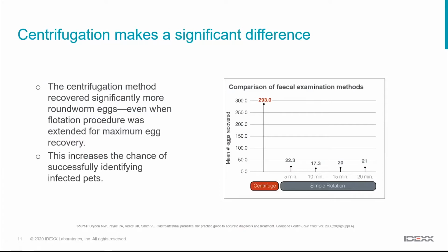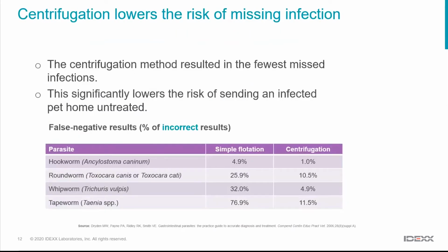And you can see there were significantly higher numbers of eggs identified using the flotation centrifugation technique. So we know that we're using a better technique in that setting.